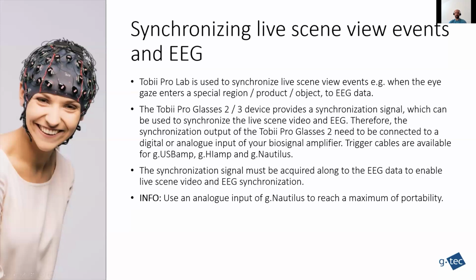And the Tobii Pro Glasses provide a synchronization signal that we're going to feed into our amplifiers, the g.USBamp and g.Nautilus. This is the signal we're going to use for the synchronization. So, the next slide.